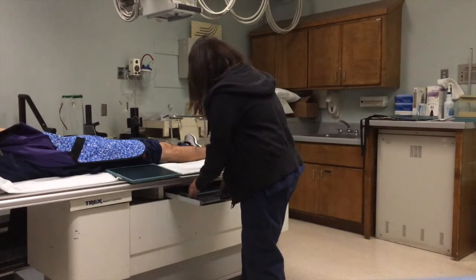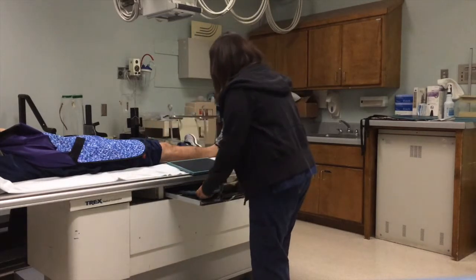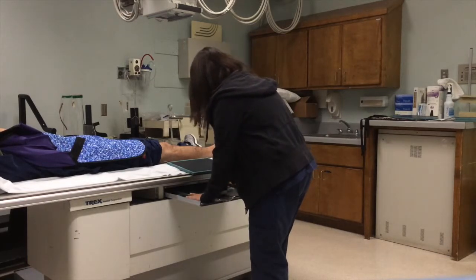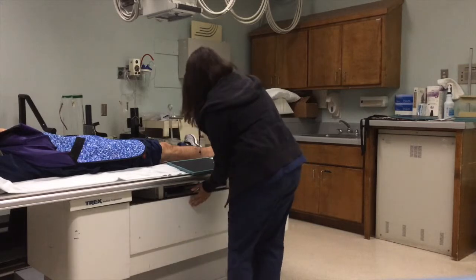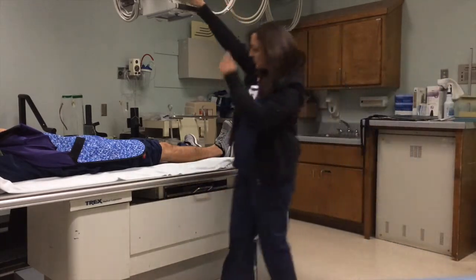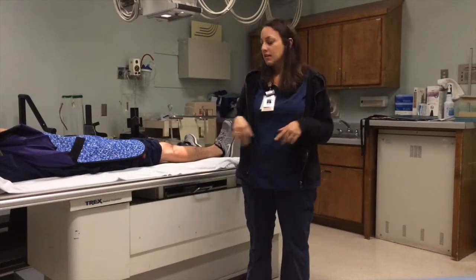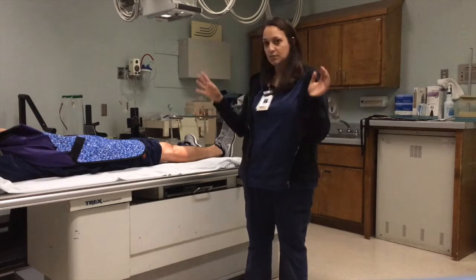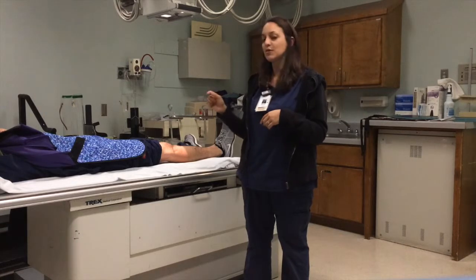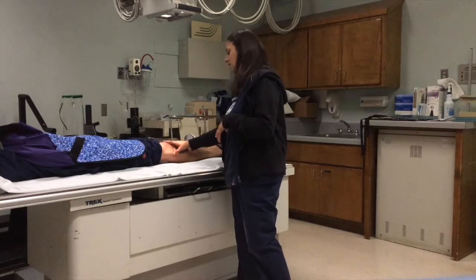For my next view, I'm also going to do a 10 by 12. I'm going to switch this out. I'm going to have the bar towards his head. I'm going to move this out of the view so there's no double exposure. Okay. So now I'm going to also center between the epicondyles of the femur and the tibia, the condyles, between mid, and then I'm also going to go about a half inch below the apex of the patella.